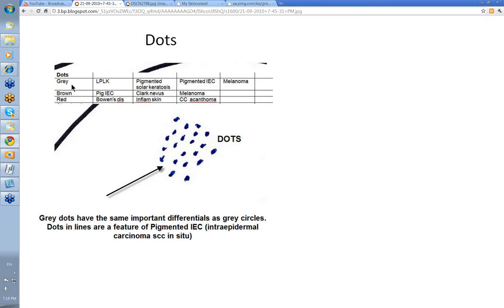The ones you really should concentrate on are the grey dots. The differential for anything that has grey dots includes lichen planus like keratosis, pigmented solar keratosis, pigmented IEC, and melanoma. It's much the same as grey circles, which we've talked about earlier.